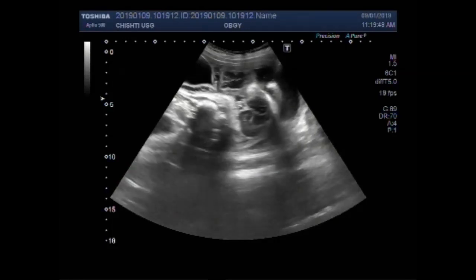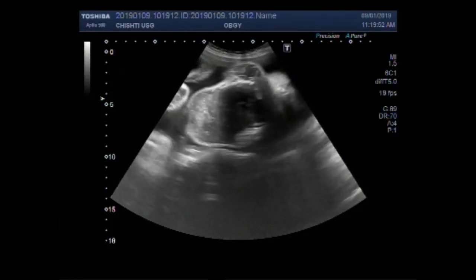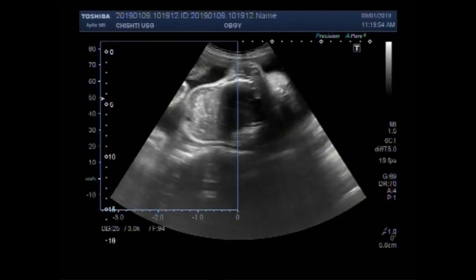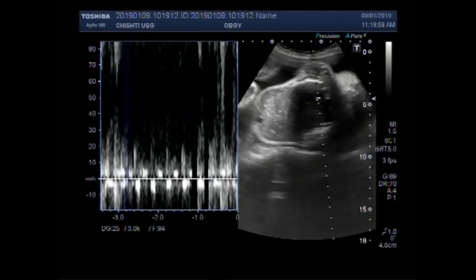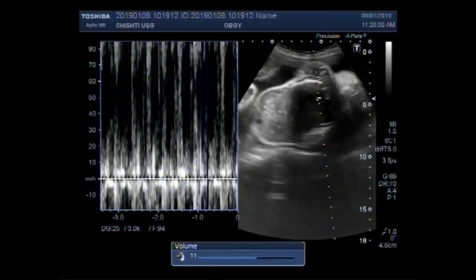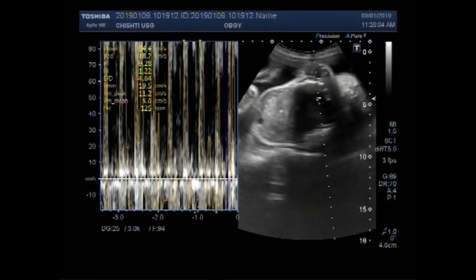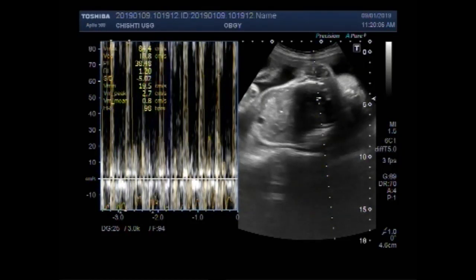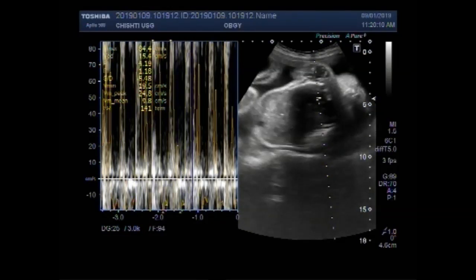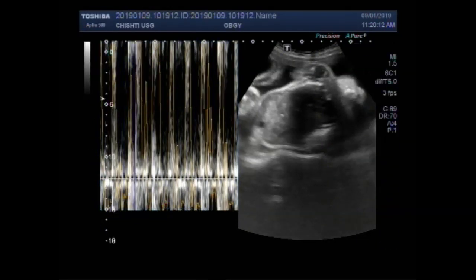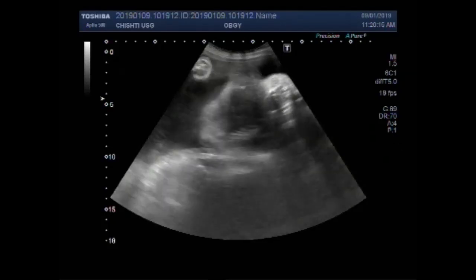Encephalocele is also known as cranium bifidum. It is a neural tube defect which is characterized by sac-like protrusions of the brain and the membrane that covers it through openings in the skull. These defects are caused by failure of the neural tube to close completely during fetal development.